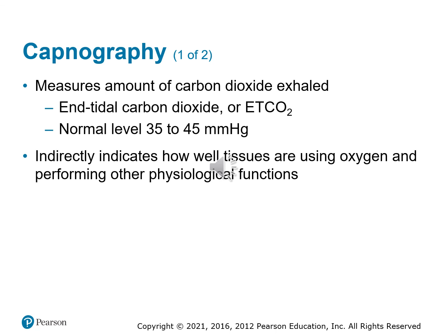But from a number of other medical standpoints, it's a very good tool for respiratory emergencies, especially those COPD, emphysema patients, to tell you how much CO2 they're keeping in their body, to tell you kind of what level of severity they're in. We'll learn about a lot of this as we go through, but this has become a very good tool in the assessment process as well.